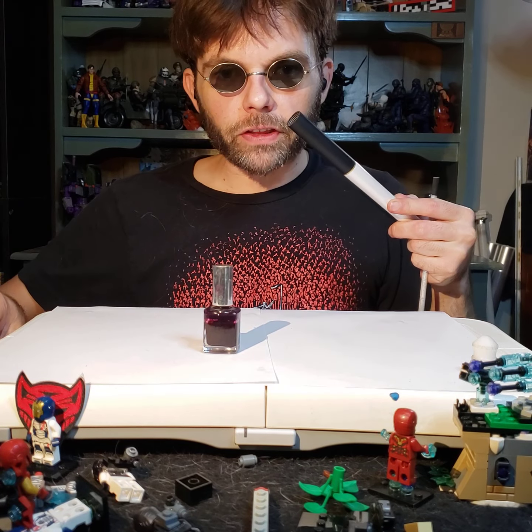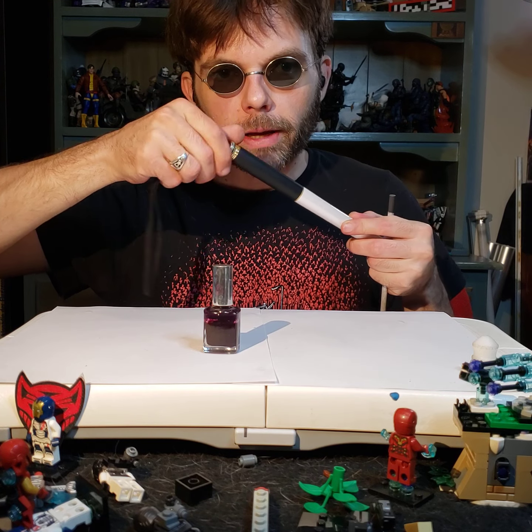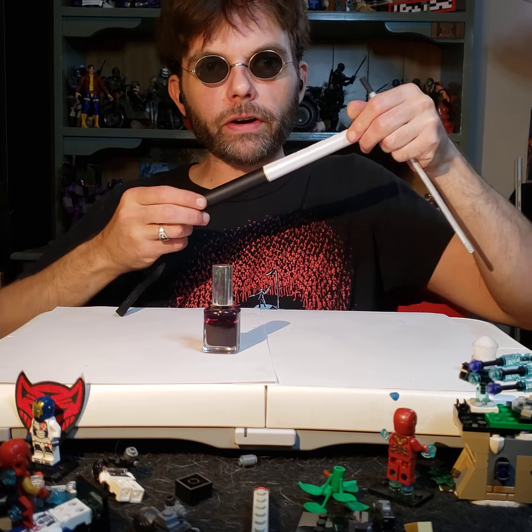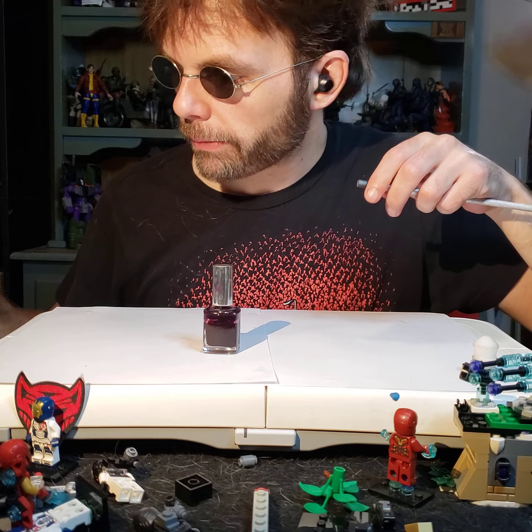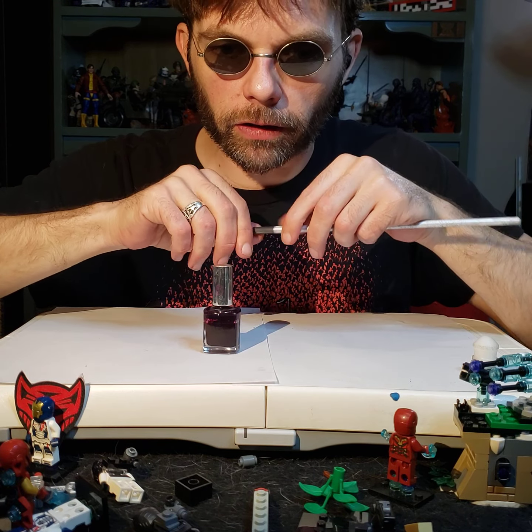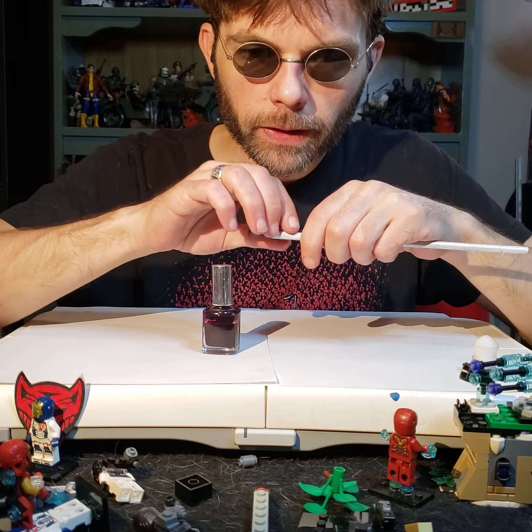Now, since I have the tip of the cane removed, I'm actually going to put the top of my cane back on because when the tip's removed, this cane can fall apart very easily if you have the place where the handle goes, the little strap. If you have that silver tip or the silver butt of your cane unscrewed, oh, your cane's going to fall apart. So we don't want that to happen. So let's get this thing lined up.